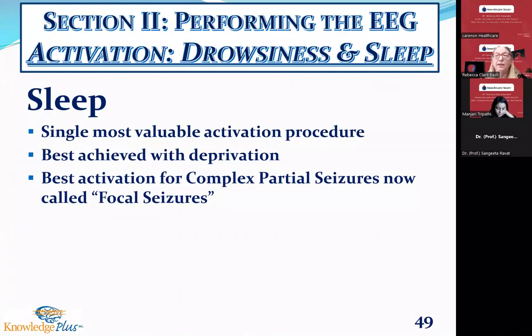The other thing that I tell every patient walking into my EEG lab, I say, I need you to go to the bathroom. It's just like putting a 5-year-old in a car for 20 minutes. If you say, go to the bathroom, they'll say, I just went, I just did it. And you get in the car and in 5 minutes, they are saying, I have to go to the bathroom really bad. This happens with our patients as well.